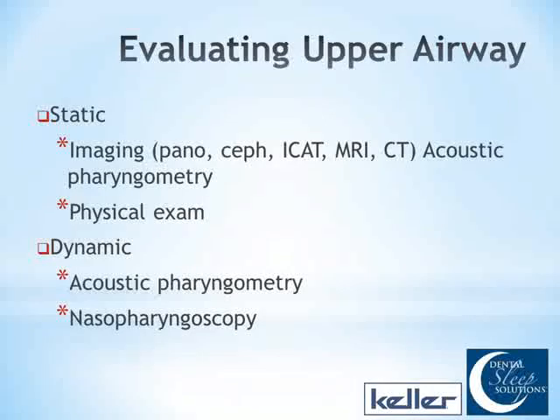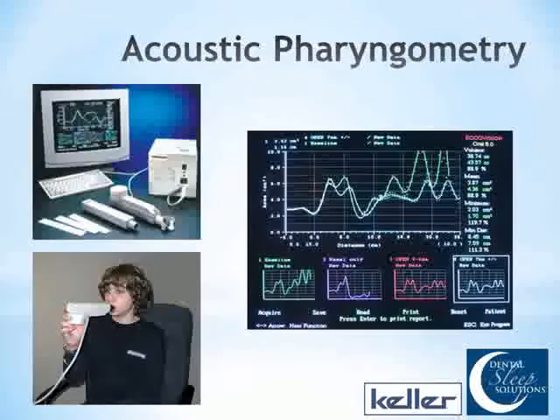No, and most dentists aren't going to have that, but it is a dynamic way to look at the airway, just like with acoustic pharyngometry. We can take a picture of something, but we don't really see how air is moving through there. If we test it with acoustic pharyngometry, here you see the machine that they hold up to their mouth, and then the graph on the right, charting distance versus surface area, and it does have some value.